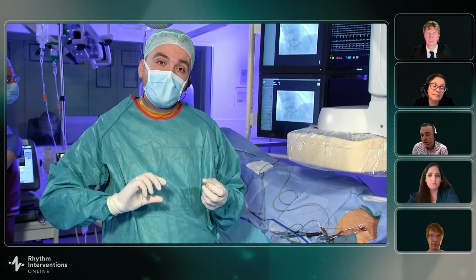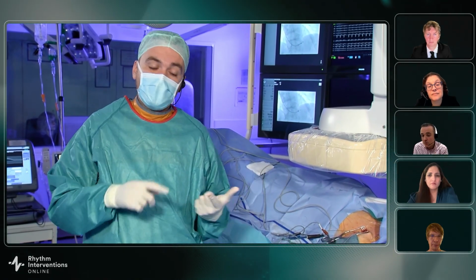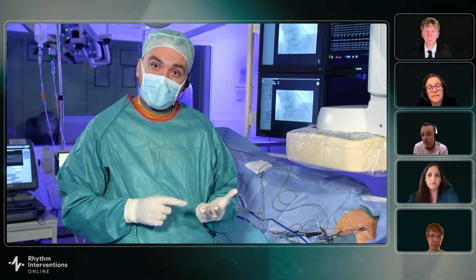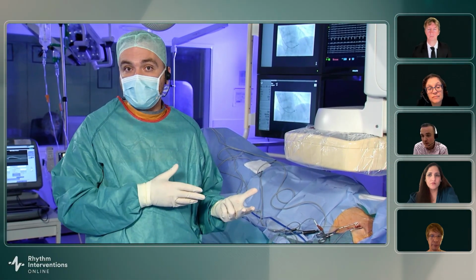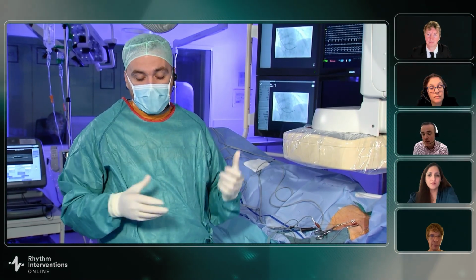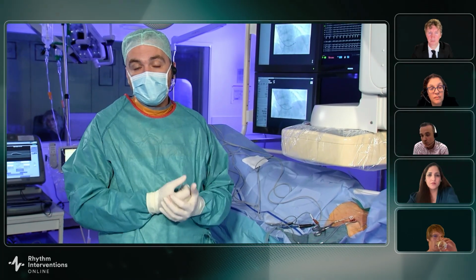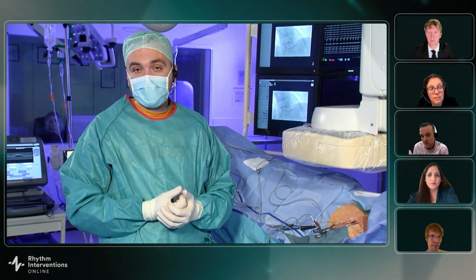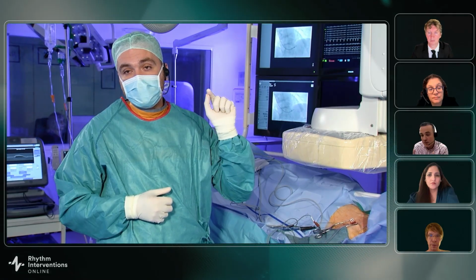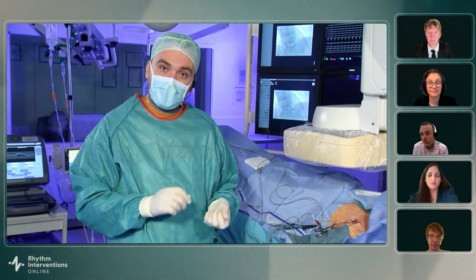To summarize the case as I showed you: first of all I start with the position to know that I'm looking at the septum, so RAO and LAO, to be sure that I'm perpendicular to the septum. Then I perform mapping to see the signal. Then I rotate my lead with 5-6 fast rotations to penetrate the septum, and we may experience the impedance going high during rotating the lead. When we reach the subendocardium of the LV, we experience a drop in the impedance. I also look at the morphology of my QRS during rotating.